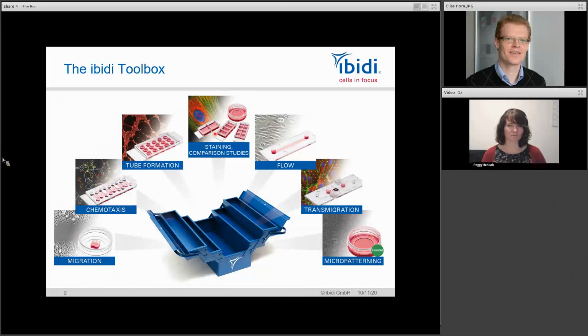You can also use collagenase, the enzyme which digests collagen. We also have a recommended collagenase product in the instructions to completely digest the collagen matrix, and then the cells are left over. That can be an option. I hope I got your question right this time, Tatiana.